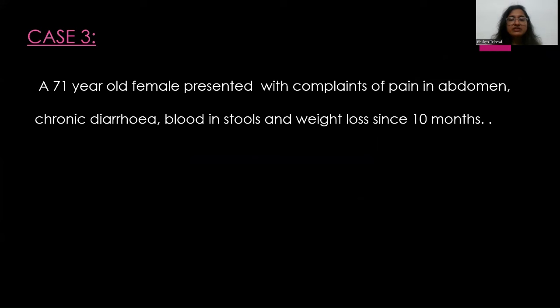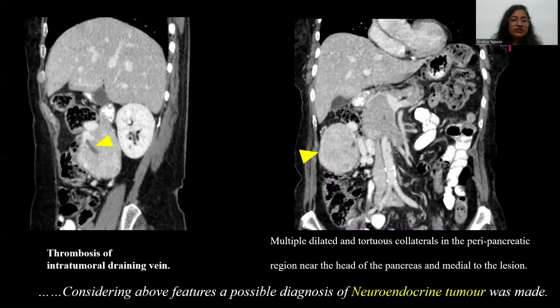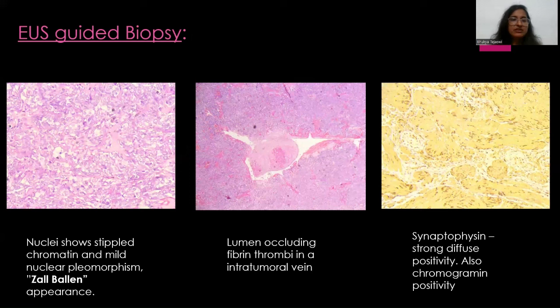My third case is a 71-year-old female who presented with pain in the abdomen, chronic diarrhea, blood in stools, and weight loss since 10 months. On CECT, an ill-defined soft tissue density mass lesion was seen in the right paracolic gutter on the lateral aspect of the distal ascending colon, displacing the colon medially. It was supplied by a dilated tortuous middle colic artery and drained by the middle colic vein, showing homogeneous post-contrast enhancement. A sagittal image demonstrated thrombosis of the intratumoral draining vein, and coronal images showed multiple dilated collaterals in the peripancreatic region near the head of the pancreas. EUS-guided biopsy confirmed NET. High-power histopathology showed nuclear pleomorphism with a salt-and-pepper appearance, and a lumen-occluding fibrin thrombus was seen in an intratumoral vein.